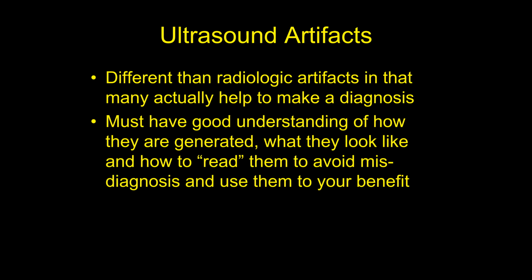Okay, artifacts. Before we get off into the exact specifics of disease processes in different organs, we have to talk about a couple of artifacts. Okay, ultrasound artifacts. We talked about there's some artifacts in radiology, but there's some in ultrasound. And the difference is in ultrasound artifacts, some of the artifacts that we see actually help us make a diagnosis.